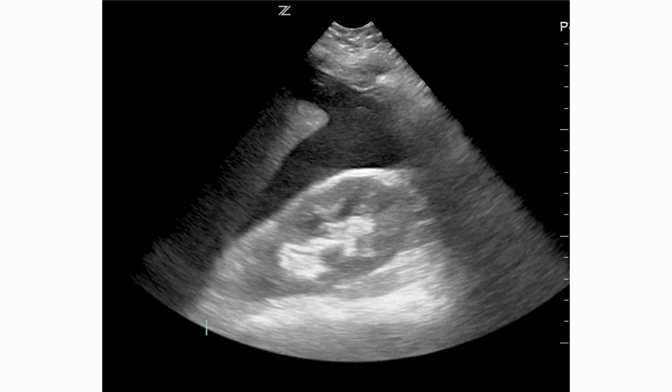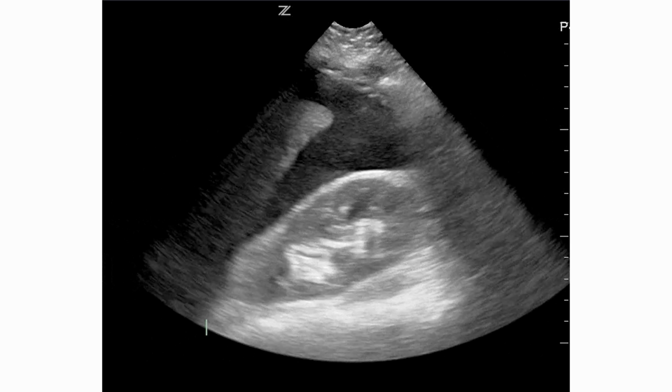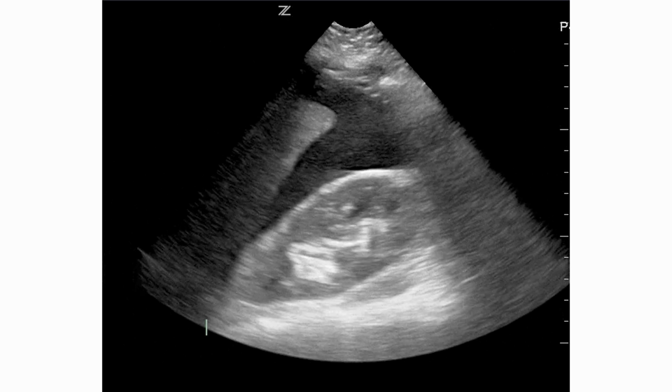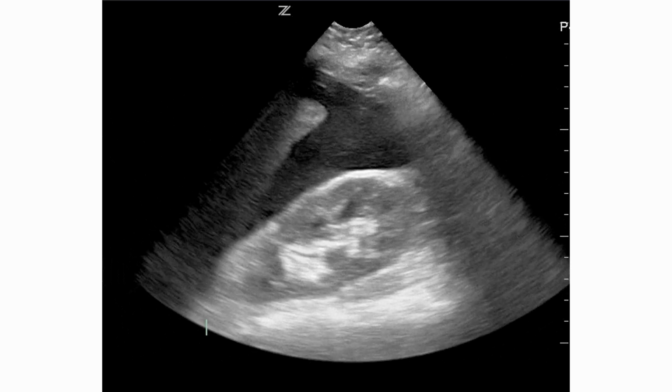So this view would be a right upper quadrant view. This would be the tip of the liver floating in a black anechoic volume that we'd be concerned for free fluid, extending into Morrison's pouch between the liver and the kidney.